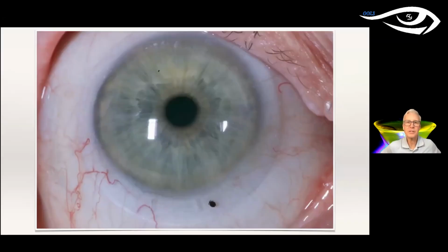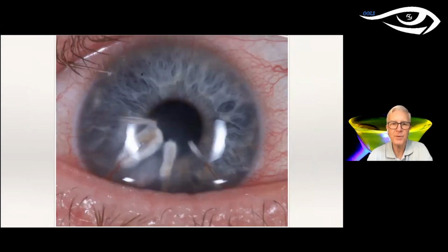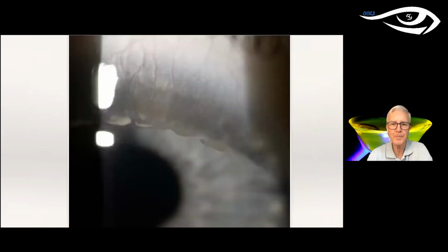So that's a little idea of how you do it. The room light is important to have it be dark. So we take some pictures, and you can see here you do see the image of the flash, but it's not like that big ring flash there. So I took all these pictures with the units that I just showed you here.